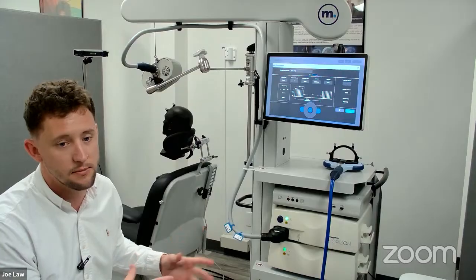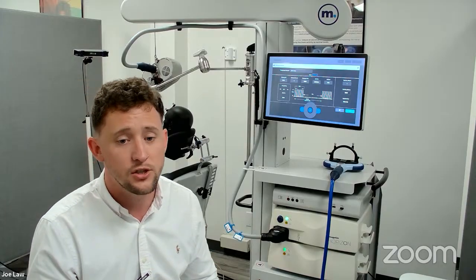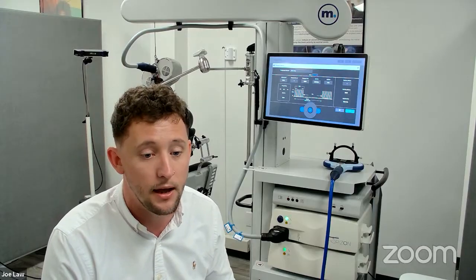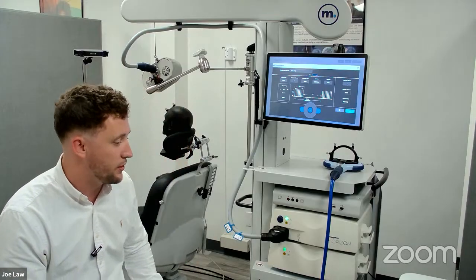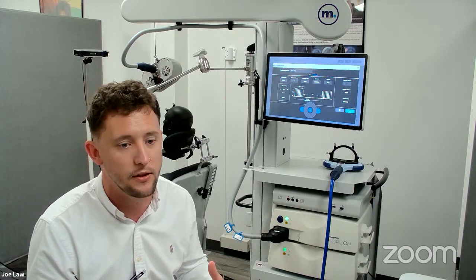Great. How long does it typically take for a first-time TMS practice to get up and running? So we offer 2 days training, which comes with the system. Somebody will come and install the system the first day, make sure everything is running okay. And then for the next 2 days, we will do a training session with everybody in the clinic. We usually say anybody that's going to get hands-on with the system should be present at the training.